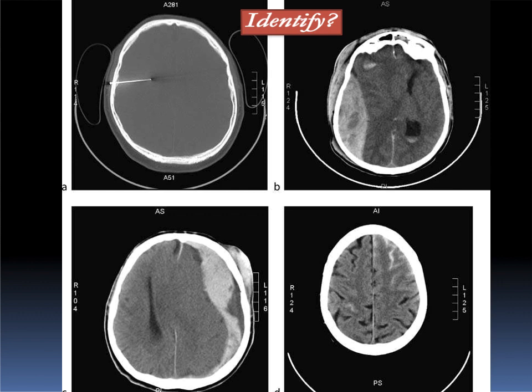So it is very good for detecting the lesions, whether extradural or subdural, any associated fractures, and subarachnoid hemorrhage.